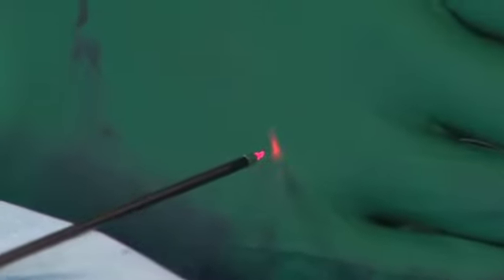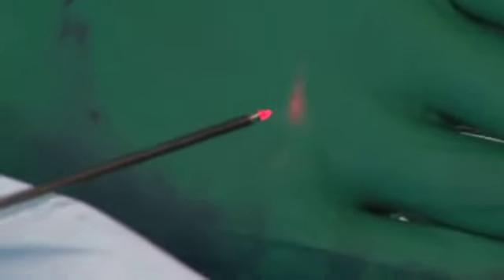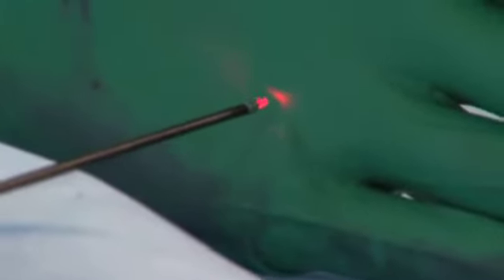You can see that arrow pointing up. That's the direction the laser is firing. You can see that I can rotate it up and I can rotate it to the side. When I rotate it to the side, I'll be using it very much like a scalpel for the septa. When I point it up, I'll be treating the undersurface of the skin. With the laser pointing down and a little bit to the side, I can take the fatty component out of those compartments. So that's really the key to this treatment.